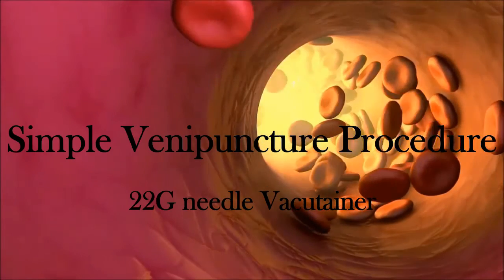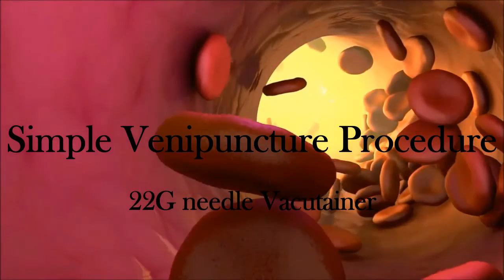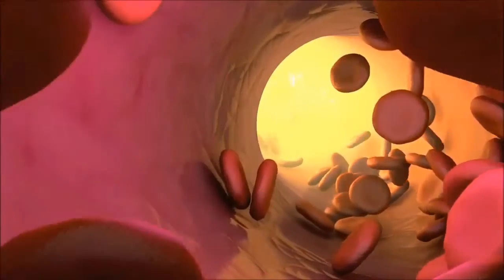In this video, we will be performing a routine venipuncture on a live patient. This is also known as phlebotomy. Phlebotomy is the surgical opening or puncture of a vein in order to aspirate blood. Each sample collected is used to monitor a patient's health status.